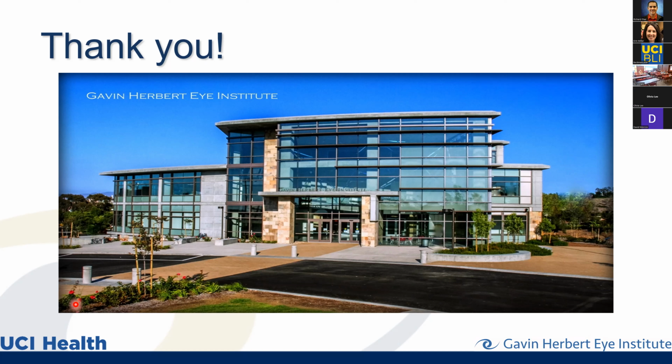In general, we try to just take as many images as the patient can take, which is actually not that difficult because we're not taking individual images. We're taking movies, and naturally the patient will move slightly. So some of the images are not good quality, and we are selecting the best quality images to examine. And when we do the data analysis, sometimes for the more severe patients we really couldn't even find good areas to examine, so maybe we just did the highest quality images.